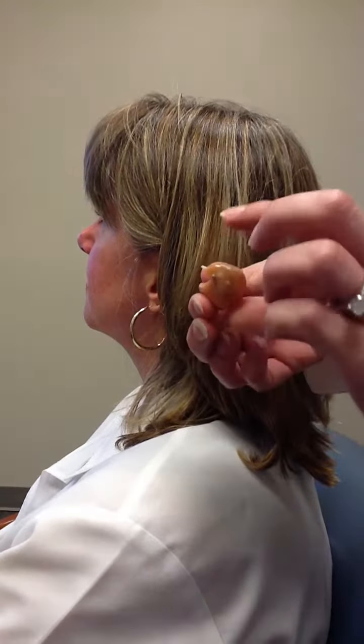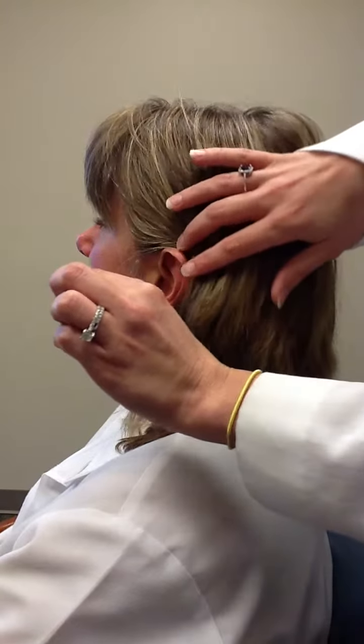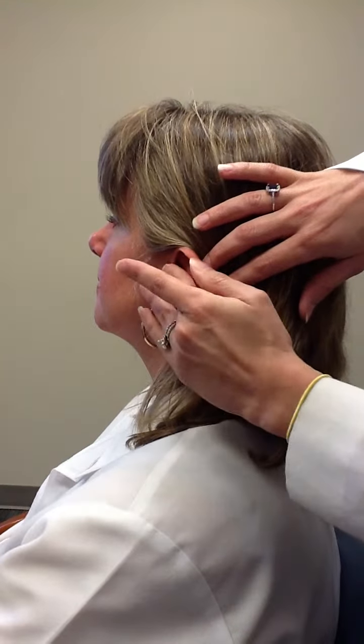So, to insert the hearing aid, you'll hold the aid like so. You'll bring the aid back to the ear, put the canal portion in first, and give it a twist to push in.